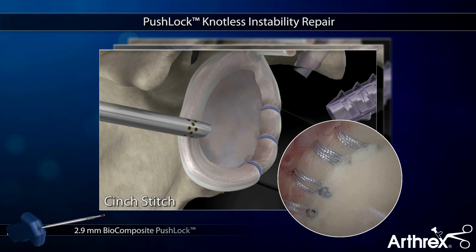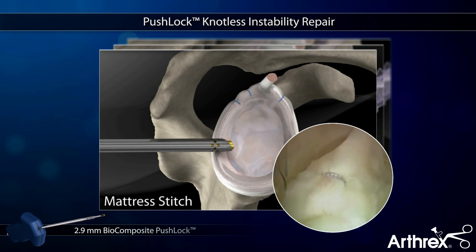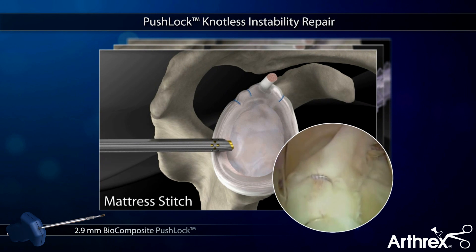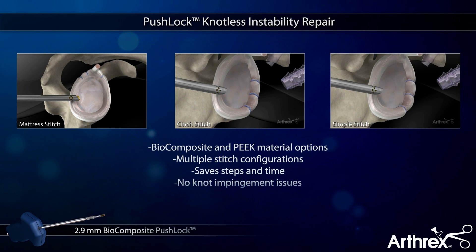The suture-first technique also allows the freedom for multiple stitch configurations like cinch stitch and mattress stitches. The knotless PushLock saves steps and valuable time while providing a secure repair that eliminates issues with knot impingement.